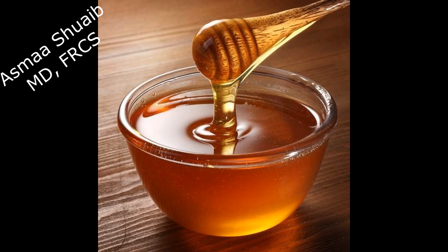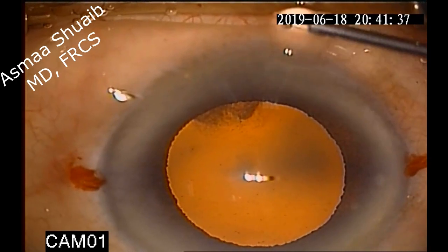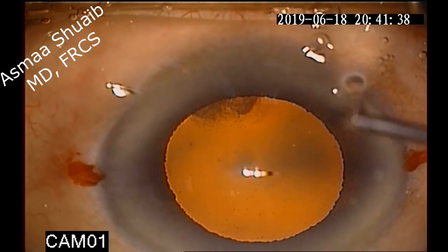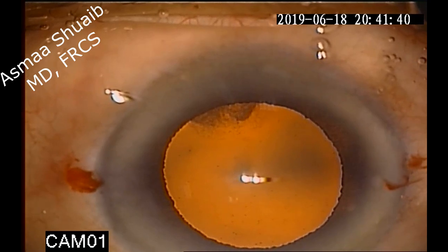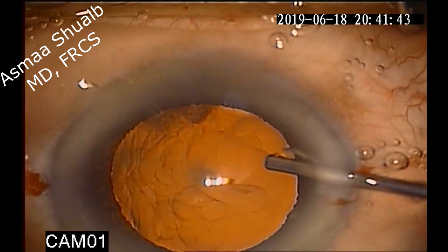Starting with the viscodispersive material, let's start talking about honey. Look at the consistency of the viscodispersive material when it is injected outside the eye and even when it is injected inside the eye.